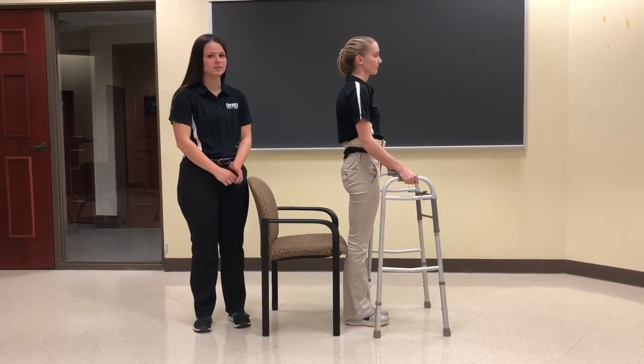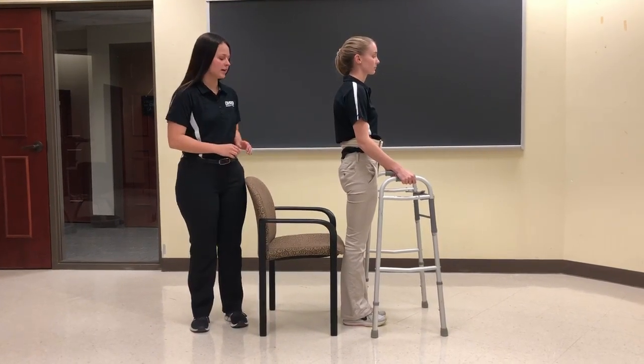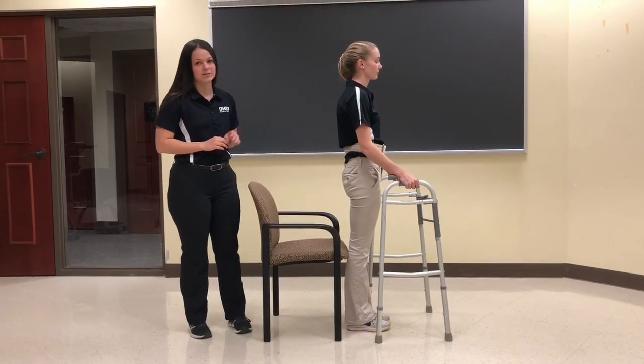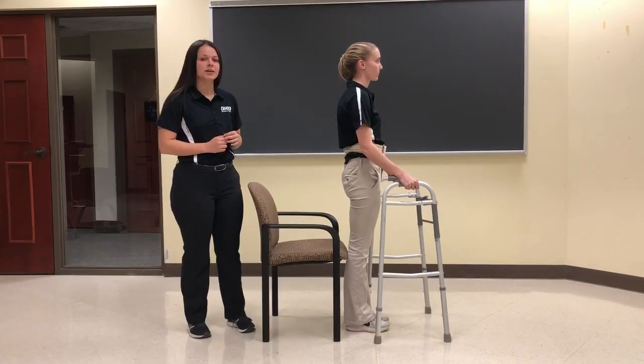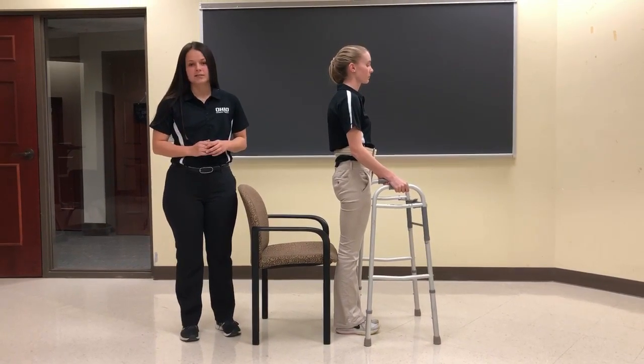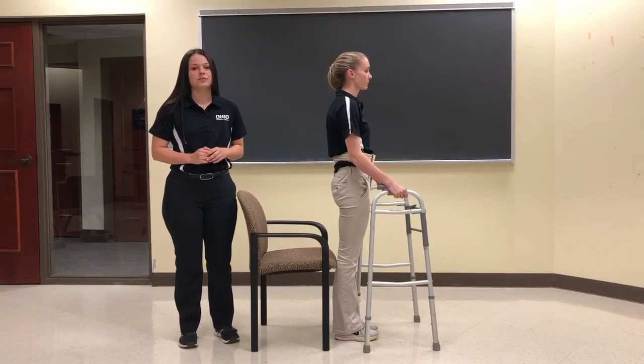Great. To move your patient from a standing to a sitting position, you want to first instruct your patient to have the backs of their legs against a secure surface. You will then stand behind the patient, maintaining a close proximity and one hand on their gait belt. You will then tell the patient to reach back using one hand at a time and slowly lower themselves to the surface as you support them as needed.